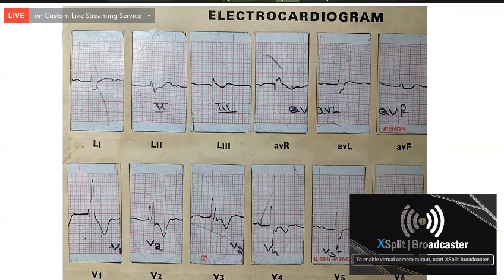And finally, any electrolyte imbalance? Hyperkalemia. So these are the 4 important reasons for a broad QRS complex. Previously, when we used class 1 antiarrhythmics, especially quinidine, sometimes quinidine could give rise to broadening of the QRS complex. But nowadays quinidine is not in use and you don't see that. You can mention that some drugs like quinidine can also prolong the QRS duration.